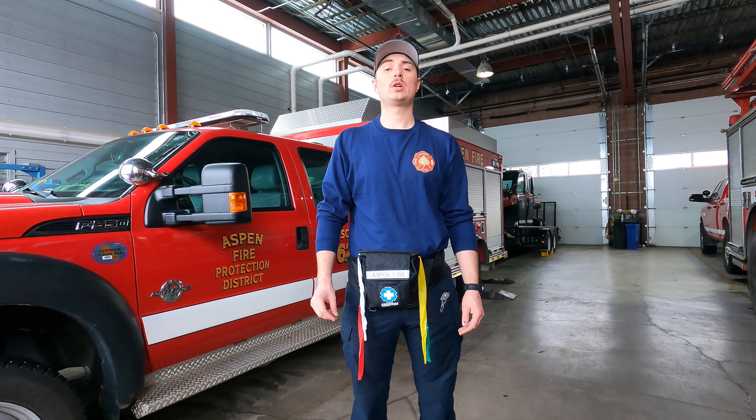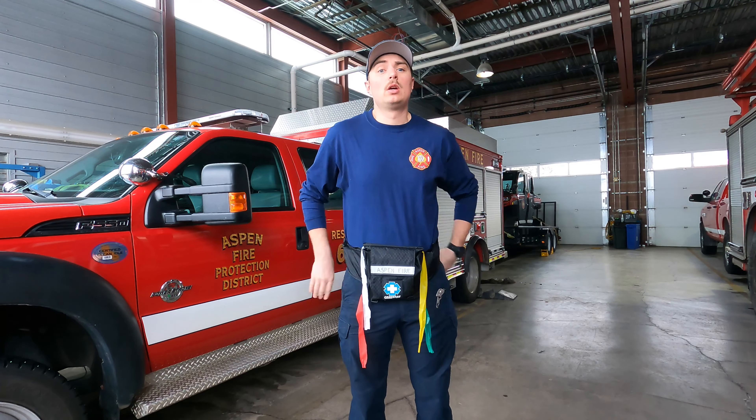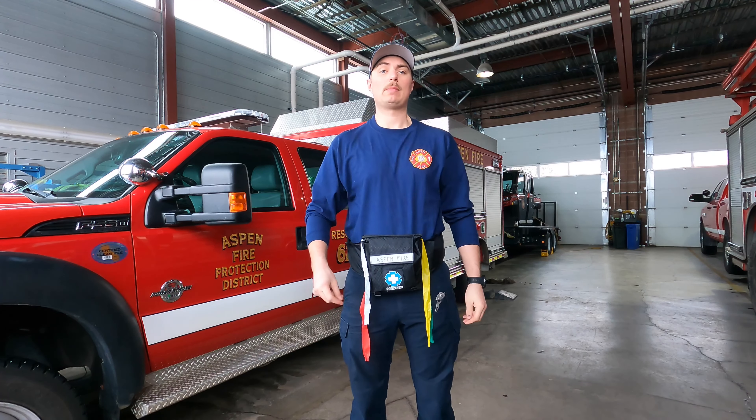Hi, I just wanted to take a minute to go over our new MCI triage fanny pack that you can see me wearing around my waist. We're going to use these to help triage patients on a mass casualty incident.